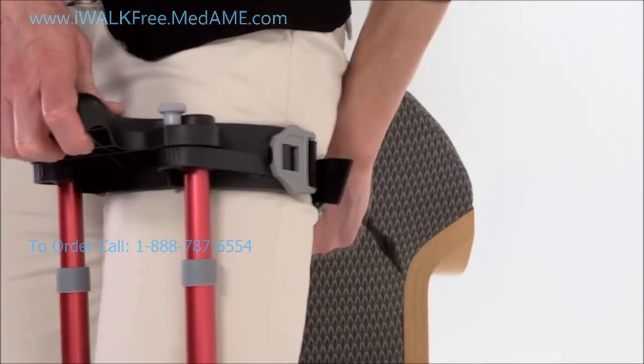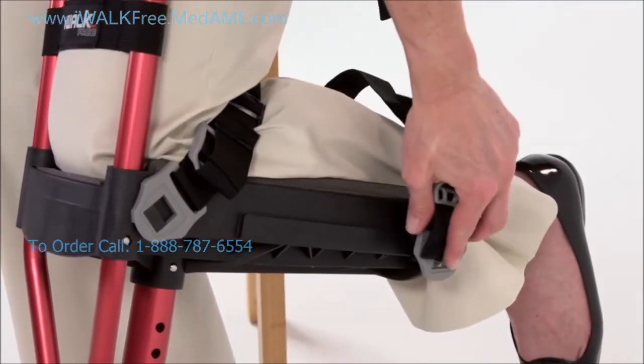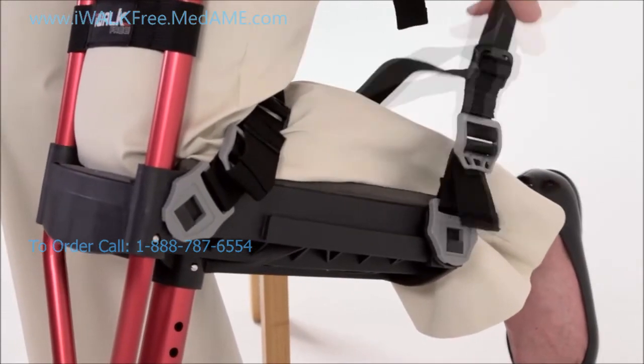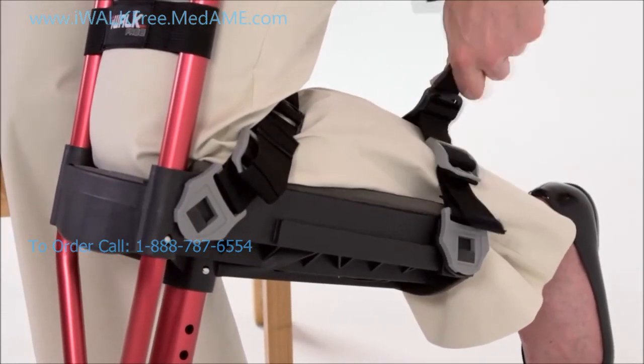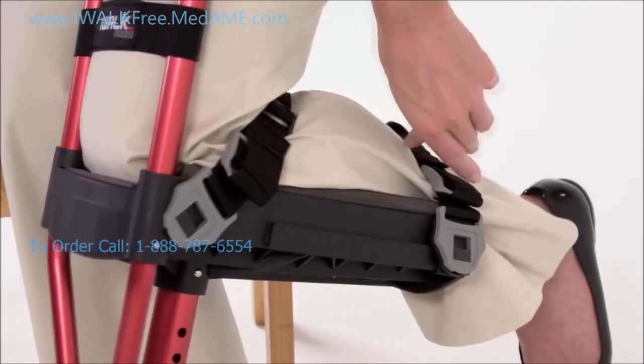Repeat this for the upper thigh strap and then finish with the calf strap. Generally you want the calf strap to be as far back as possible, but if you have a cast, boot, brace, or condition that needs accommodation, you can slide the strap forward to where it best functions.